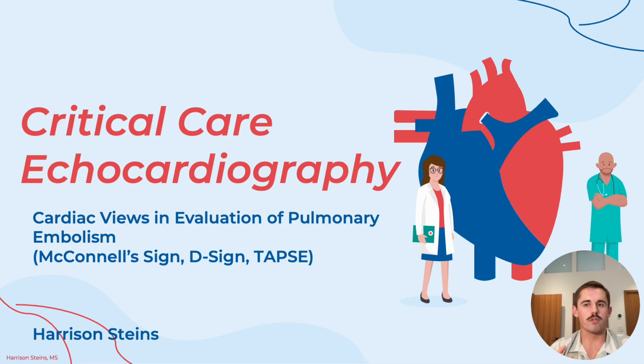And this is especially useful for medics or for deployed teams in settings where high DVT and PE risk exists, and you don't have further imaging access or the ability to extricate someone to, say, a tertiary or secondary care center where there is greater access to imaging.